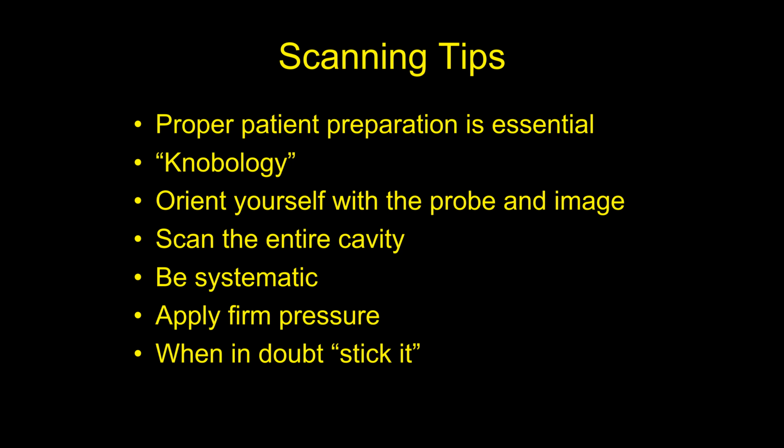And you have to remind them, no, look up here. While you're doing that, you need to look up at the screen and see the effects of what you're doing. You want to orient yourself with the probe in the image. You want to know which side, when you're looking at that image, is cranial, which side's caudal, which side's right, which side's left. And if you start turning your probe around too much in different directions, you'll lose focus on where you're at. So you always want to keep in mind which side's cranial, which side's caudal, and your orientation of the probe.